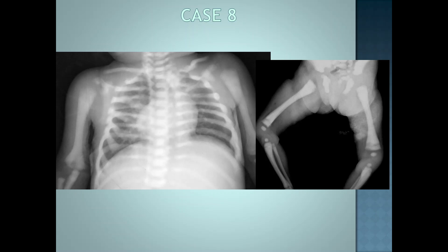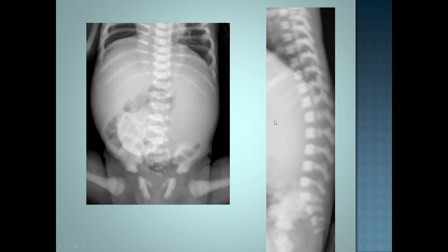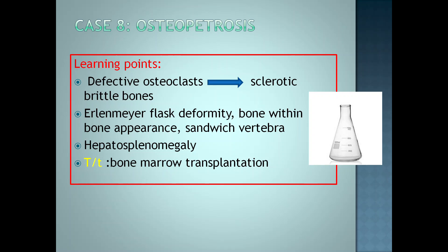This is the 8th case of a small child where there is diffuse abnormality in all the visualized bones. There is increased sclerosis and density of the ribs, spine, and long bones, with an Erlenmeyer flask deformity of the long bones — that is metaphyseal widening and undertubulation of the long bones. Abdominal radiograph shows hepatosplenomegaly. The spine has a typical sandwich vertebra appearance. This is a case of osteopetrosis — a condition characterized by defective osteoclasts, which leads to formation of sclerotic and brittle bones prone to fractures. Imaging-wise, there is Erlenmeyer flask deformity, bone-within-bone appearance, and sandwich vertebra. Clinically, there will be hepatosplenomegaly. Treatment is bone marrow transplantation.